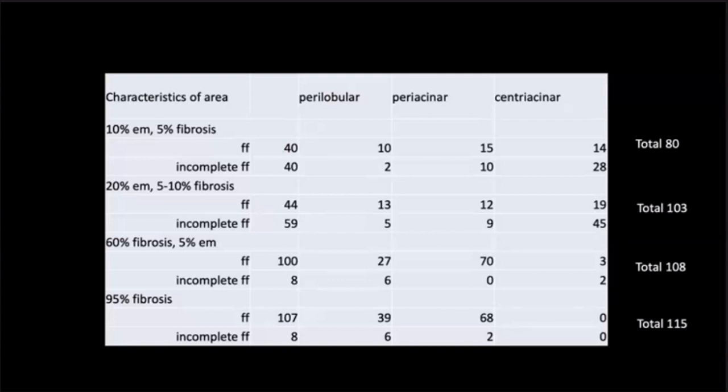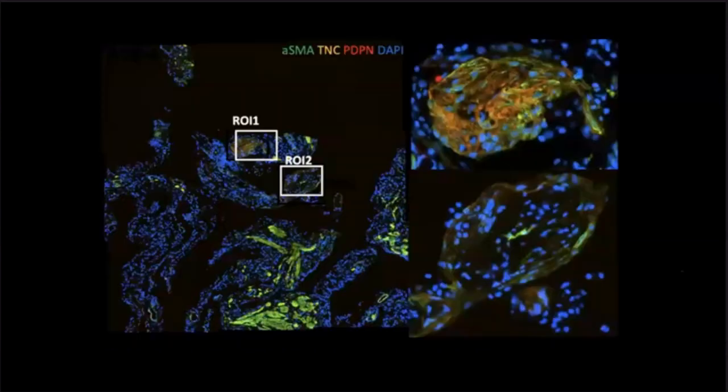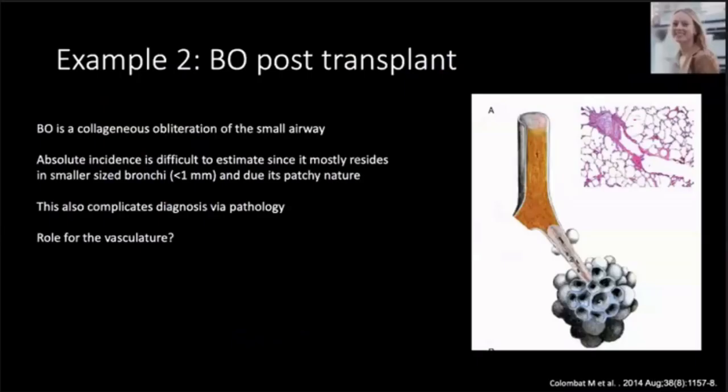And this is something we're investigating now in more detail, and that we're also trying to relate to the biology of the fibroblastic focus, because now we want to investigate if the biology of the focus is different in these areas of heavy fibrosis and in these normal appearing areas. And this is a staining that has been done by our collaborator in Bern, Dr. Janine Beute-Schniering, where you can see proof of concept that we can do this multiplex staining on exactly those areas. And the next step now will be to quantify the nature of the fibroblastic focus in more detail.